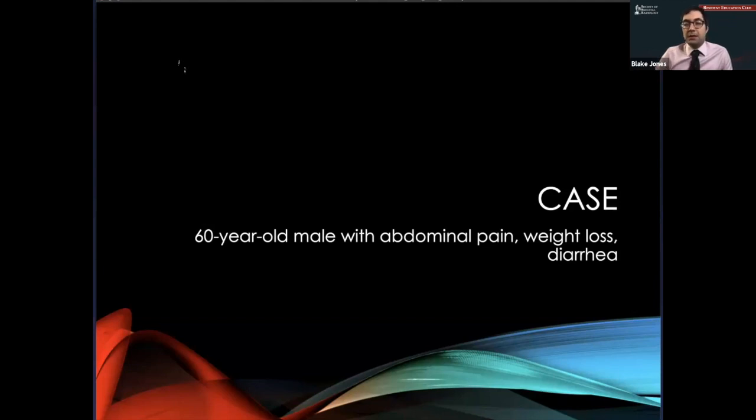The reason that we say that is just empirically, basically studies of when they took lesions and looked at the ADC values, and the ones that had the lower ADC value were more likely to be malignant. So it's more of an empirical finding, but that's one of the purported possible explanations for why that might be the case, as far as I know.